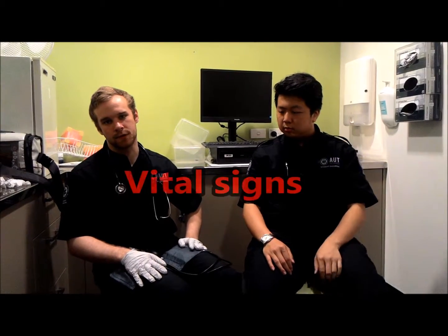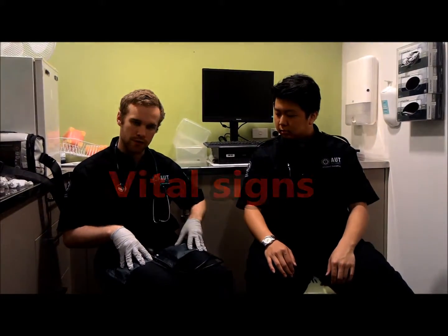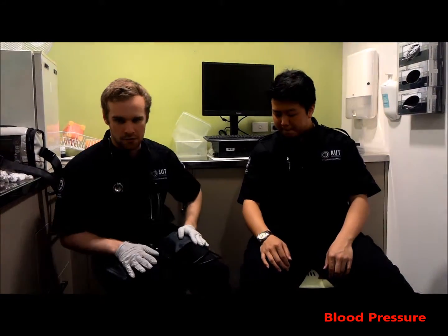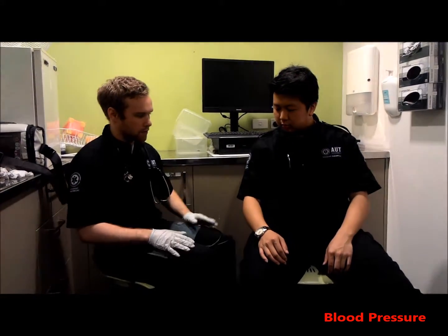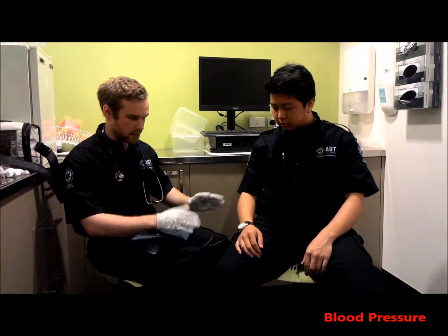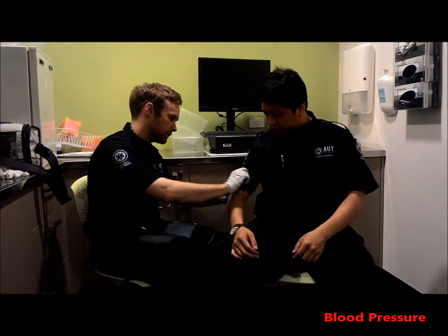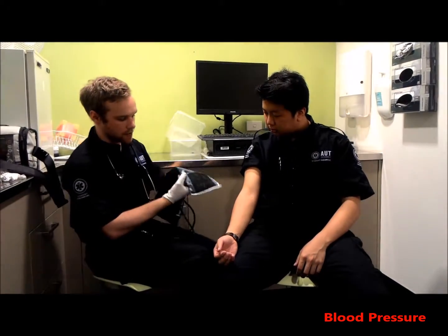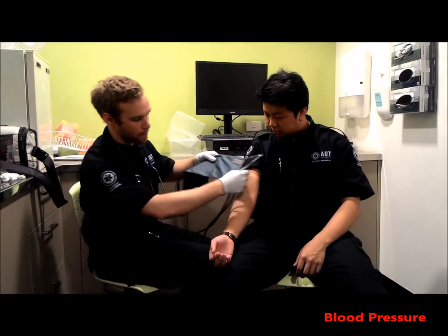Proper use of a blood pressure cuff. First of all, before you do this, you need to gain the consent from the patient. So is it alright if I take your blood pressure? Yep. Great. So next, you want to take away any restrictive clothing from the arm that you're going to be taking the blood pressure from. Next, you want to place the blood pressure cuff on with the artery mark of where his brachial pulse will be.